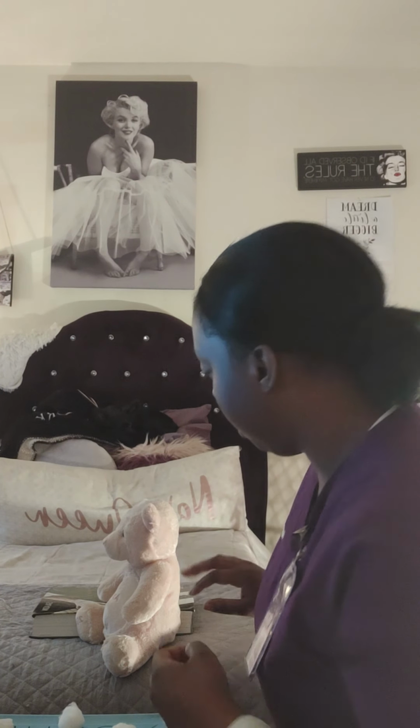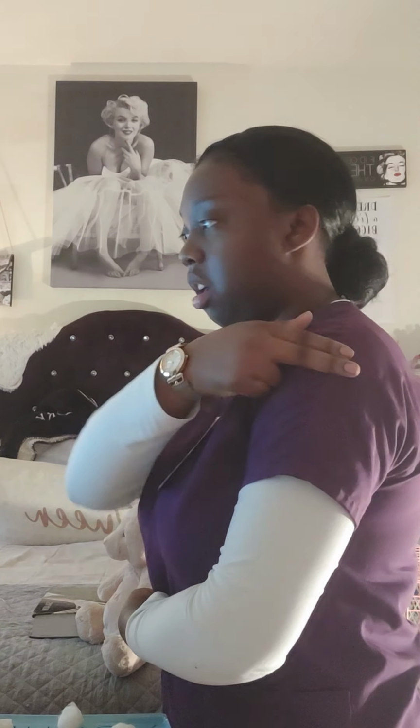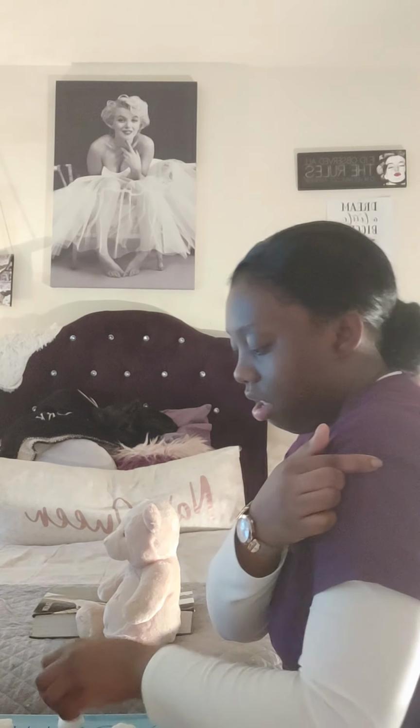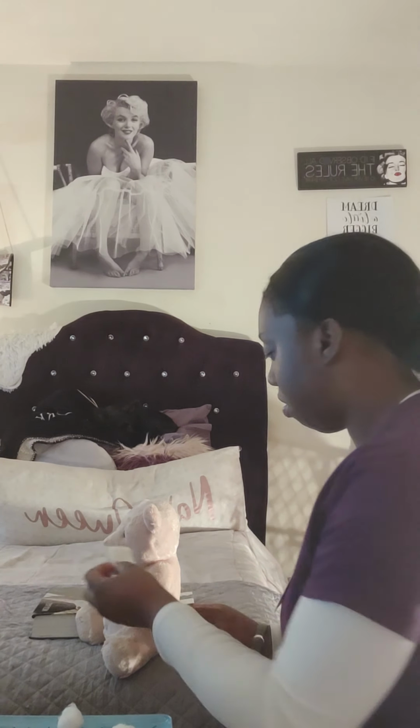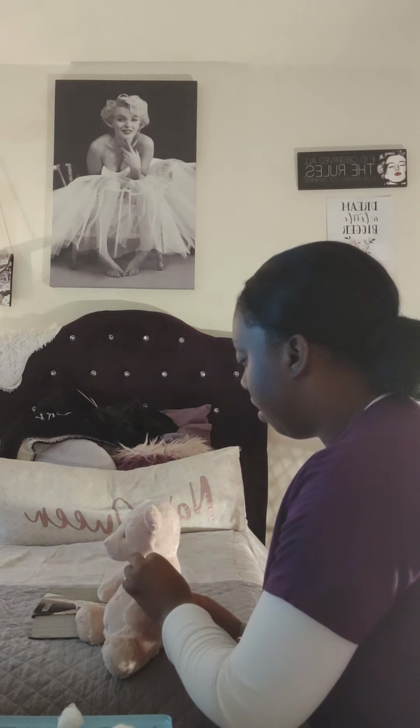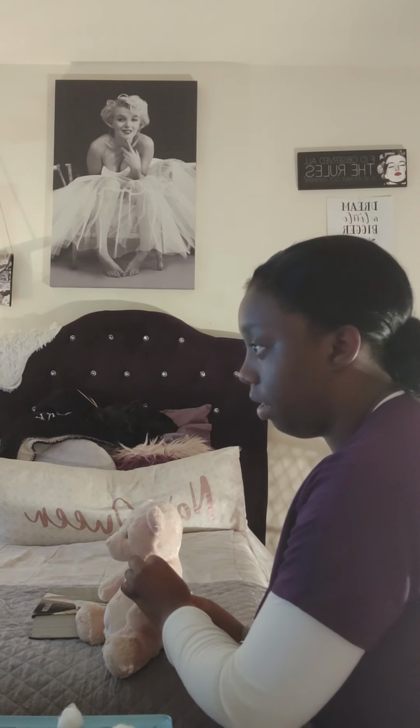So once you've inspected the area where you're going to give it, I can show it on myself. You're going to give it about right, so 2 inches, 2 fingers down from this part of your shoulder. Give it about right there normally. So once you've located the landmark, you go ahead and take your alcohol and cleanse the area, inwards to outwards again.